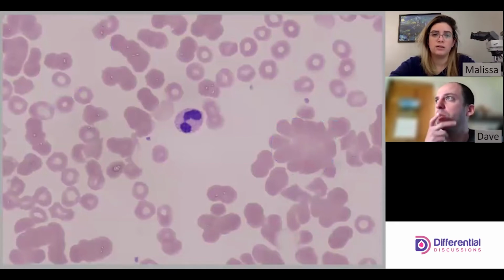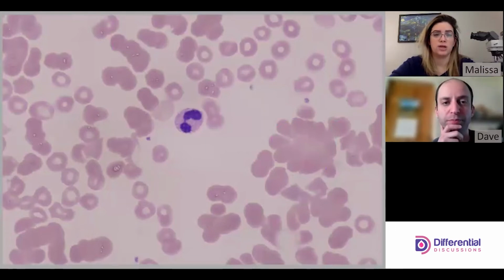The only other thing is thinking about these antibodies. They're typically IgM, so they're typically cold, but cold depends on the strength of the antibody. When it's a really strong antibody, it reacts at room temp. Room temp is technically cold. If we're 37 degrees Celsius, room temp is 20 to 25 degrees Celsius.